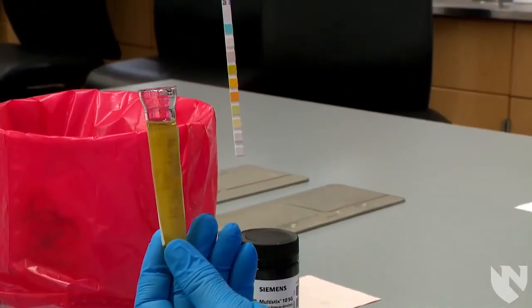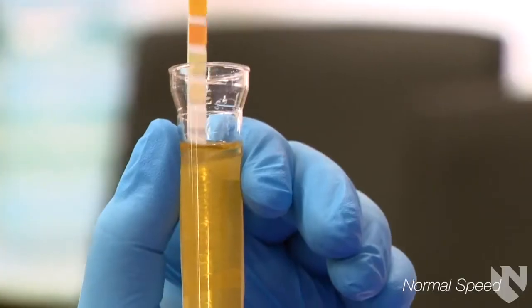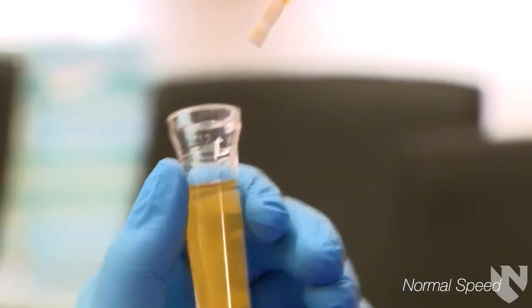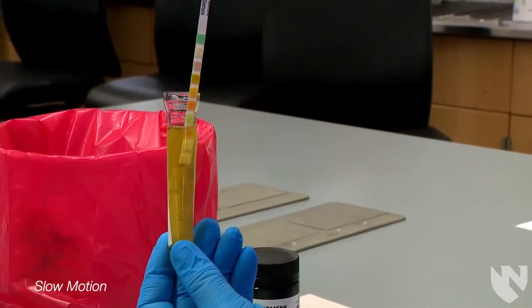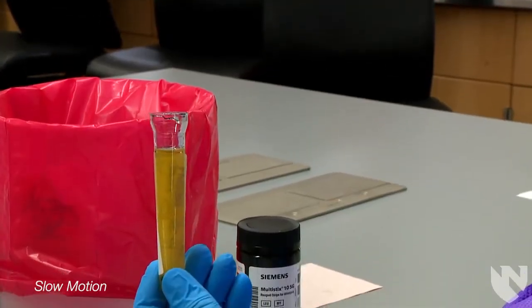Hold the specimen in one hand, and with the other, pick up the reagent strip and hold it vertically with the reagent pads facing you. Dip the reagent strip into the urine, making sure all the reagent pads become immersed in the urine. Once all the reagent pads have been immersed, immediately remove the reagent strip from the sample, and as you remove the strip, gently run the edge of the reagent strip against the rim of the conical tube.